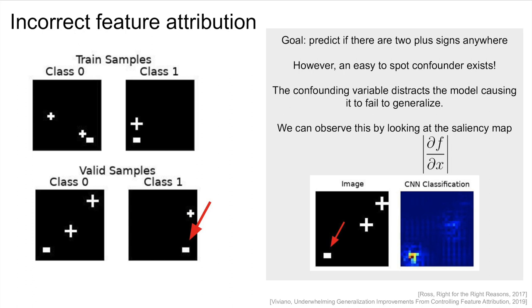With this, we observe what would happen to the output if we changed a pixel value higher or lower. Looking at the absolute value of the gradient will allow us to see zero as blue and a positive or negative gradient as a bright color. There are many fancy saliency map approaches, but at the core they are just using this gradient. Here we see that the model is in fact looking at the distractor to make these predictions.